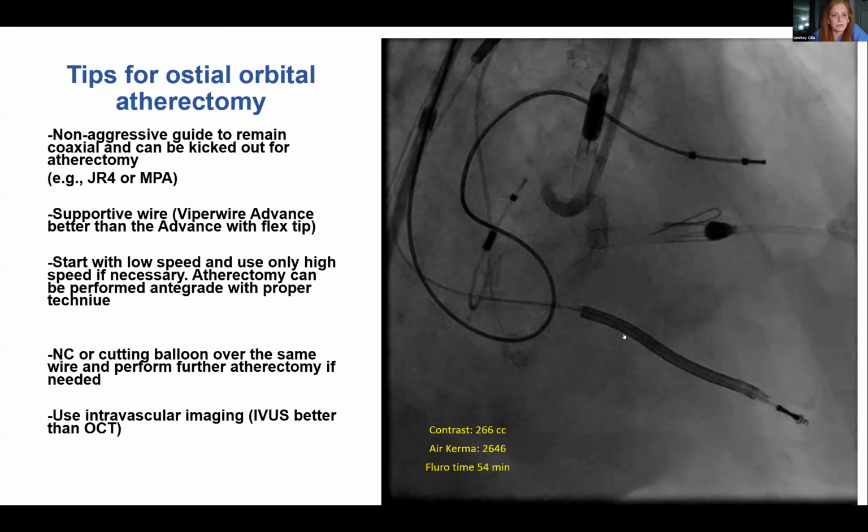I actually just had a quick question. Going back to protecting the side branches in Rota, what is the largest burr? You would have to use an 8 French system, I'm assuming. What is the largest burr that you can use in the 8 French system? Is it a 1.5 or a 1.25 for protecting the side branch with the FineCross microcatheter? You mean to deliver the burr or crown through the guide extension? Sure. Well, when you're also protecting the side branch at the same time.